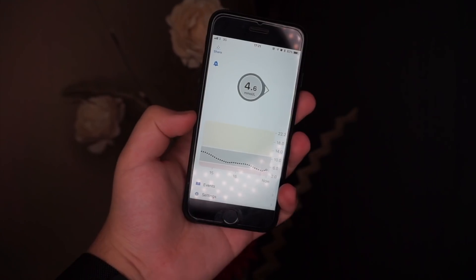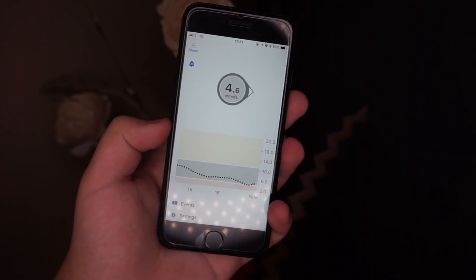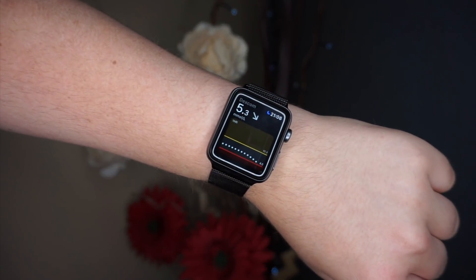The Dexcom app looks incredible — really basic and simple in a good way, nicely designed. The best thing is the Apple Watch app, which is without a doubt the best-looking CGM Apple Watch app available. In terms of usability it's okay, but some things are overly complicated, like the alarms.